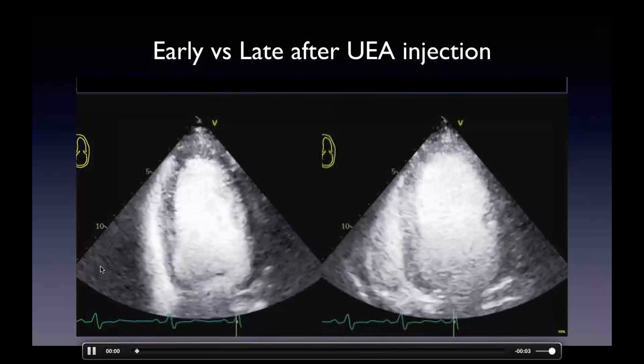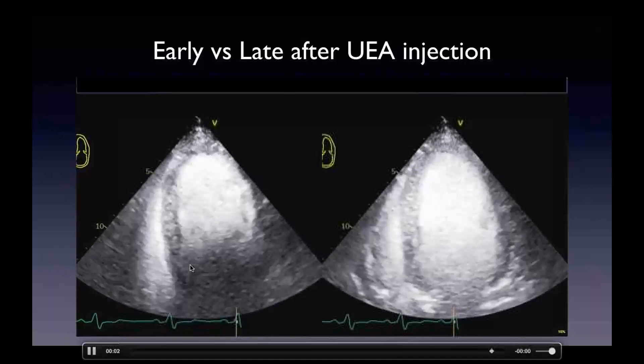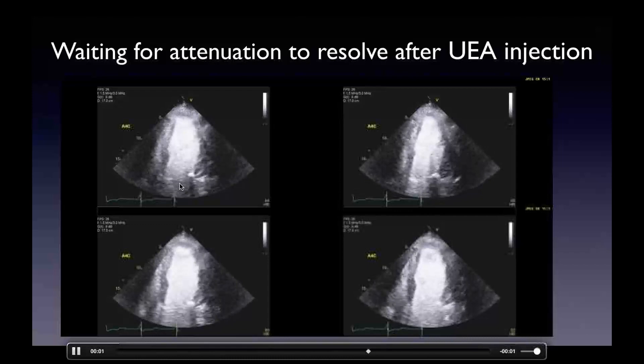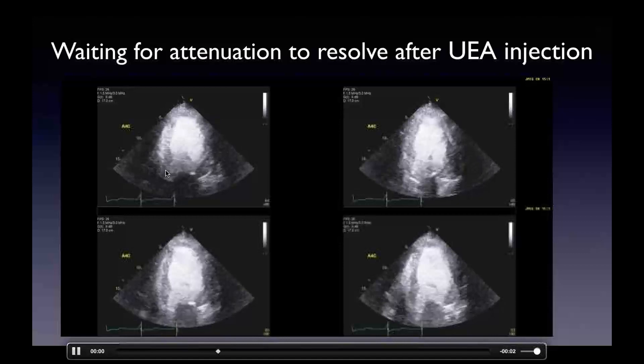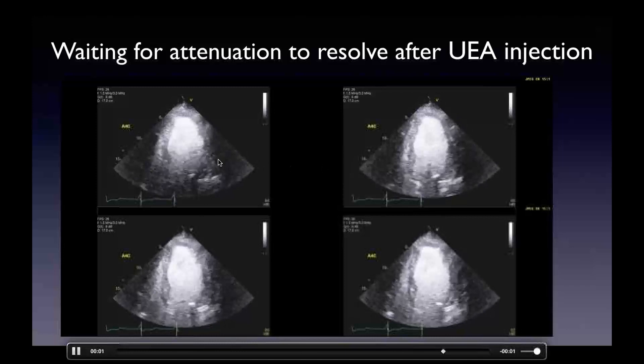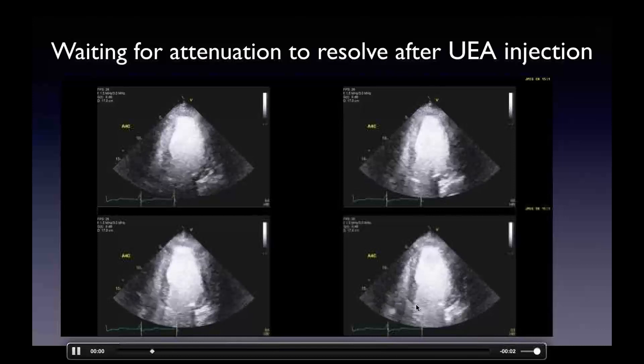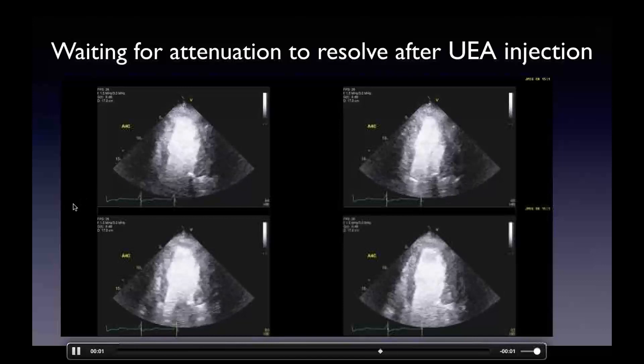In our lab, we actually started capturing early to capture the right ventricle as well before attenuation becomes too high. If you have attenuation at the base in the apical view, you can see in diastole new contrast comes in through the mitral valve — so you just wait a few seconds and the basal segments get better and better. After four or five seconds, you can see right down to the base and the mitral annulus. You could also use a flash to destroy bubbles and decrease concentration a little bit faster, but you don't want to flash too much.